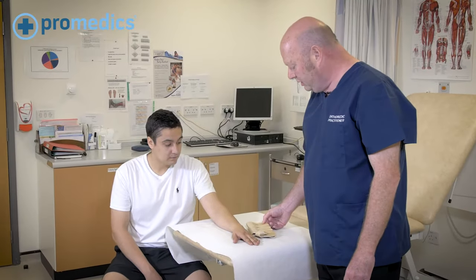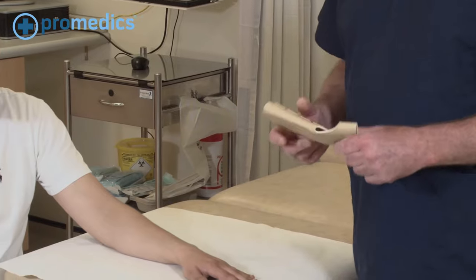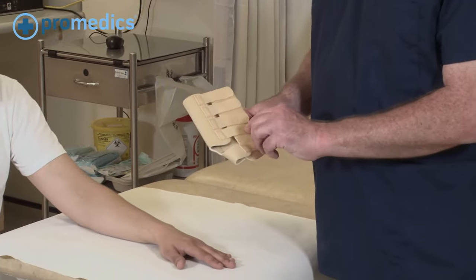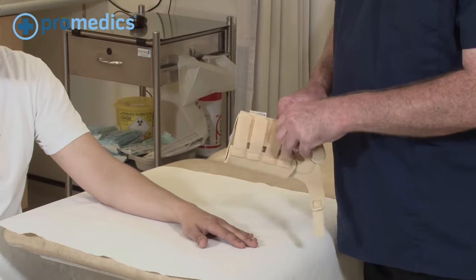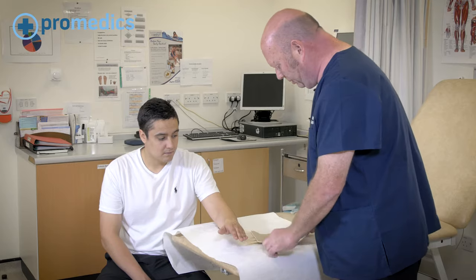Today we're going to show you how to apply a standard wrist brace. Having determined the correct size for the patient, what you need to do is undo all the straps and lay it flat down on the table.